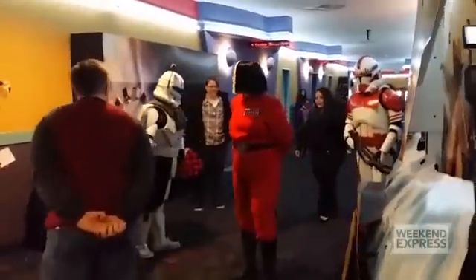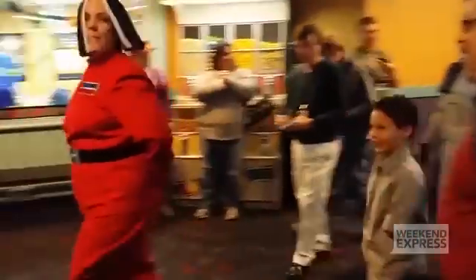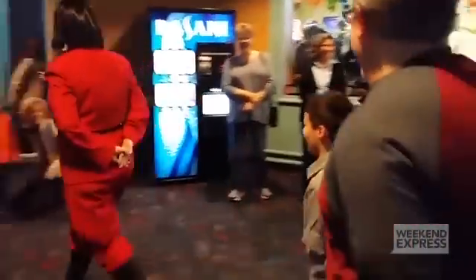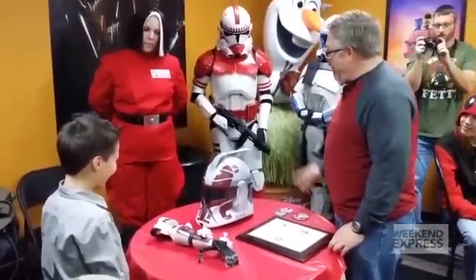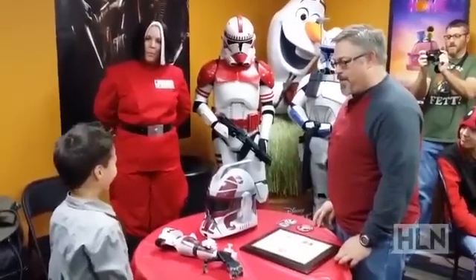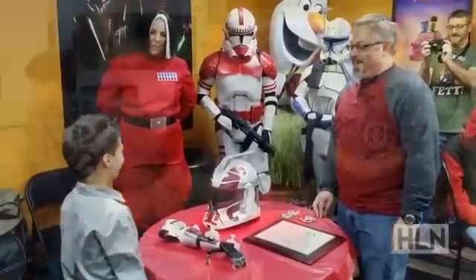You may remember this little guy we first introduced you to who needed a prosthetic hand, but he thought the usual ones were just too boring. So there is a group out there that made sure he got the coolest new hand and arm out there, made specifically for him with a 3D printer of all things.